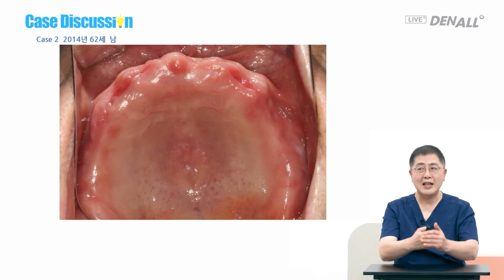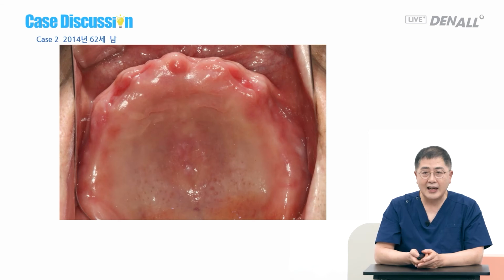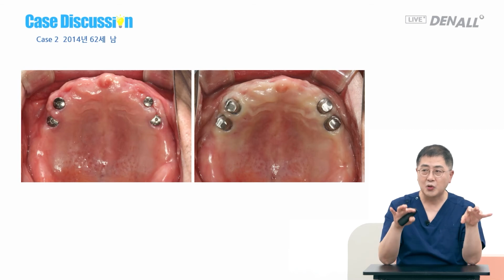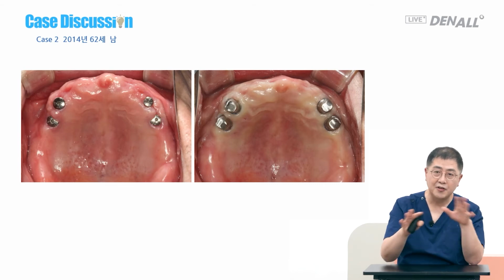For an edentulous case, a full denture can work very well when a denture is there in the mandible. Here is my favorite approach. 2 implants are placed at each side. The locations would be 3-4 or 4-5 or 5-6.